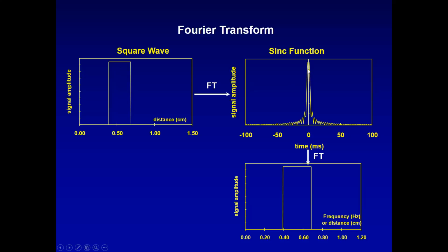So that means that the center of this, representing nothing happening in the picture, is going to come down in amplitude, and the outsides will increase. And if you find a calculator for Fourier transform and a square wave, you can test this on your own. But that's the concept. The fewer edges we have, the more middle of an object we have compared to edges, the bigger the middle of the signal is going to be.